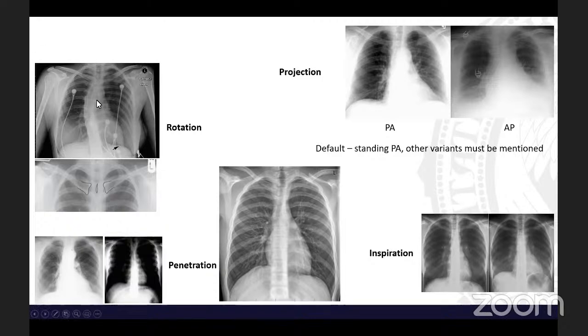And it can change the whole transparency of the lungs. The lungs can get just whiter. One lung, the whole lung, can get whiter just because there is a rotation. It's actually one of the most common causes if you have the whole hemithorax whiter, it's usually because of rotation. So when you have problems with a whiter hemithorax, just look for rotation.